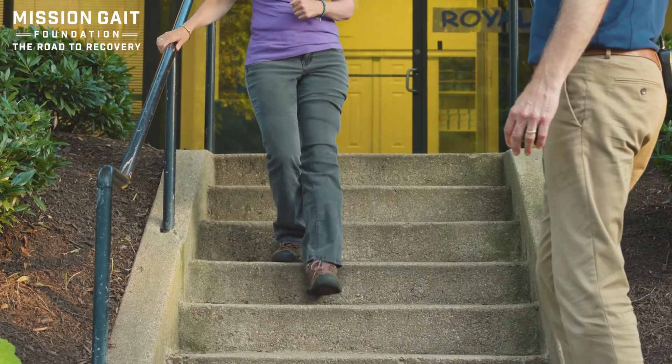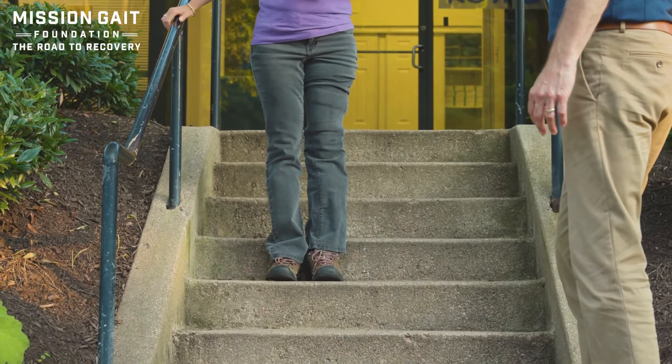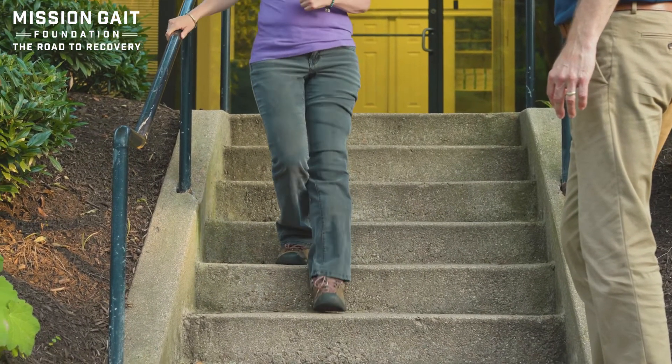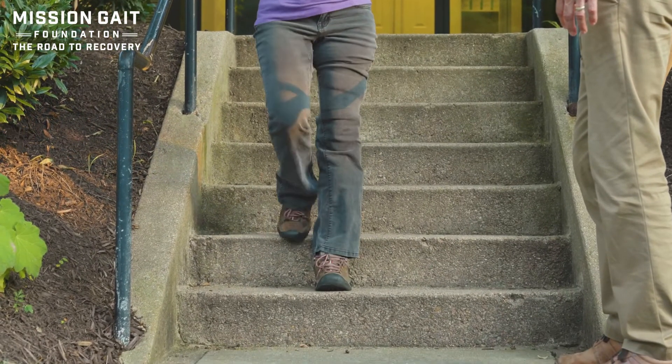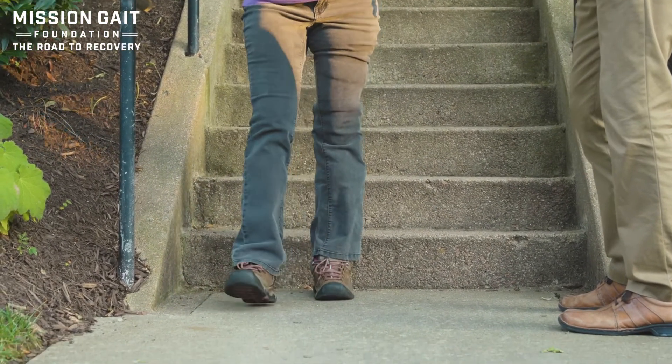Coming straight down on the heel. You don't want to lean back to the point where you fall back on the steps — you want to come straight down onto the heel and midfoot. And when you get to the bottom, step away.